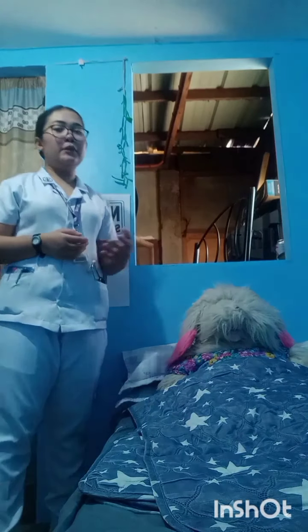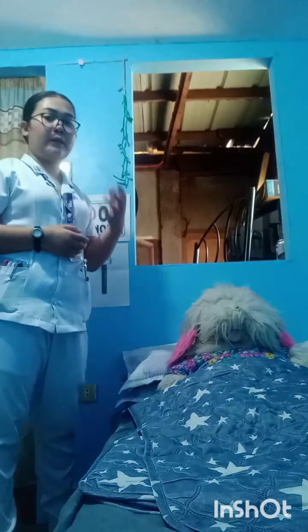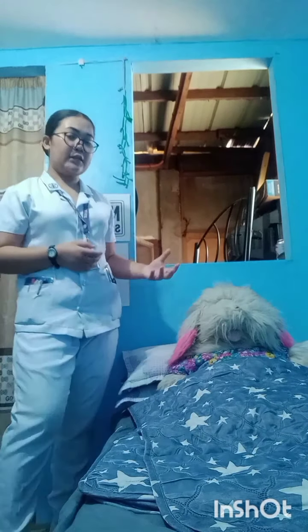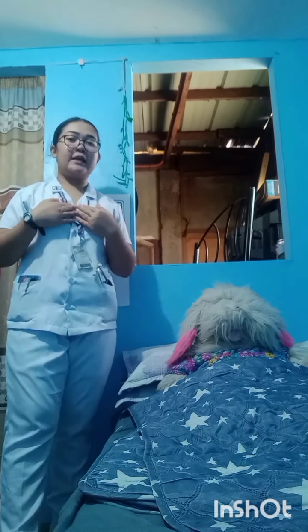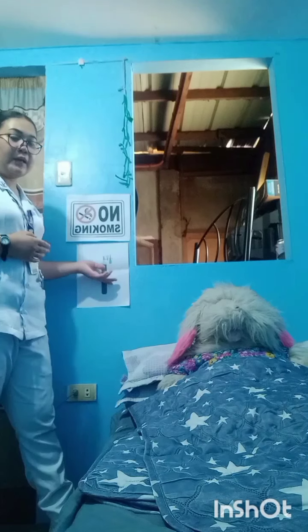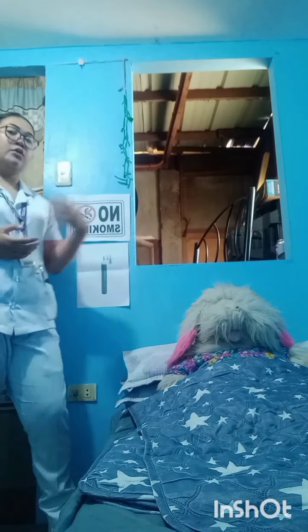Pero kung may laman pa yung humidifier bottle natin, marami pa, no need to fill it again. So, in filling the humidifier bottle, it should be done before coming to the bedside of the patient. So, assuming na na-fill ko na siya, no need for me to fill it again.